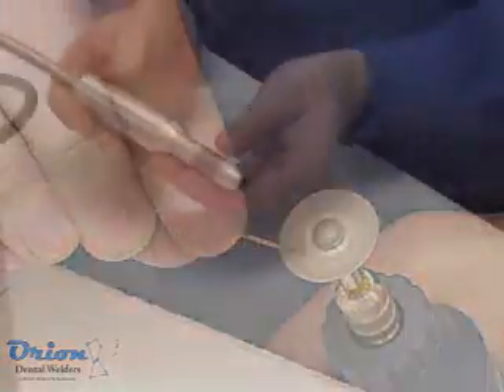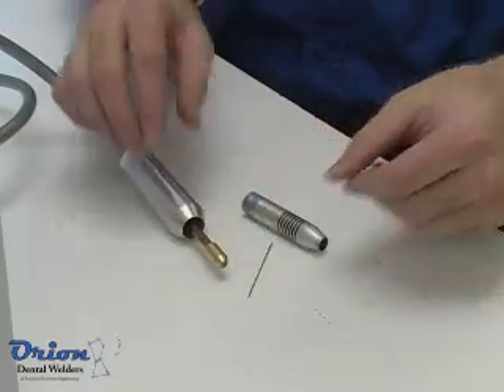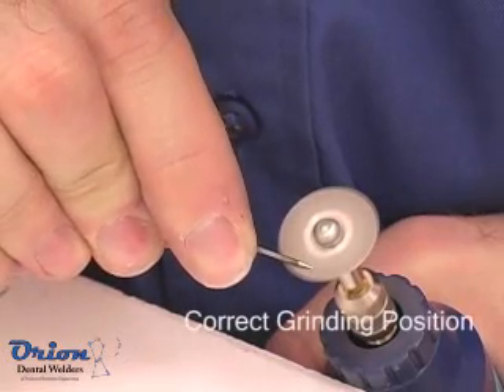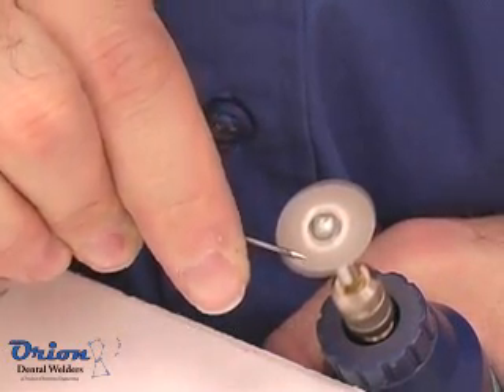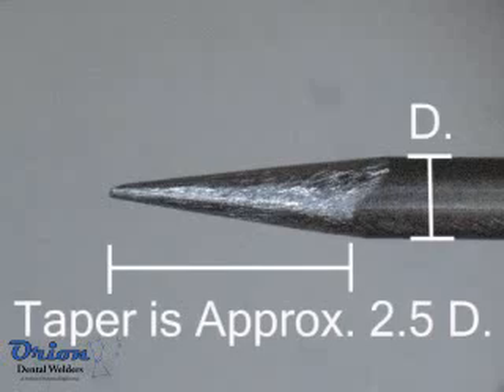Proper electrode maintenance is the key to pulse arc welding success. The Orion's quick change electrode system makes maintaining your electrodes quick and easy. A small and inexpensive Dremel tool using a diamond grinding disc is perfect for electrode sharpening. Always grind the electrode so that grind marks run parallel to the electrode shaft. The taper of the electrode should be approximately 2.5 times the diameter as shown.